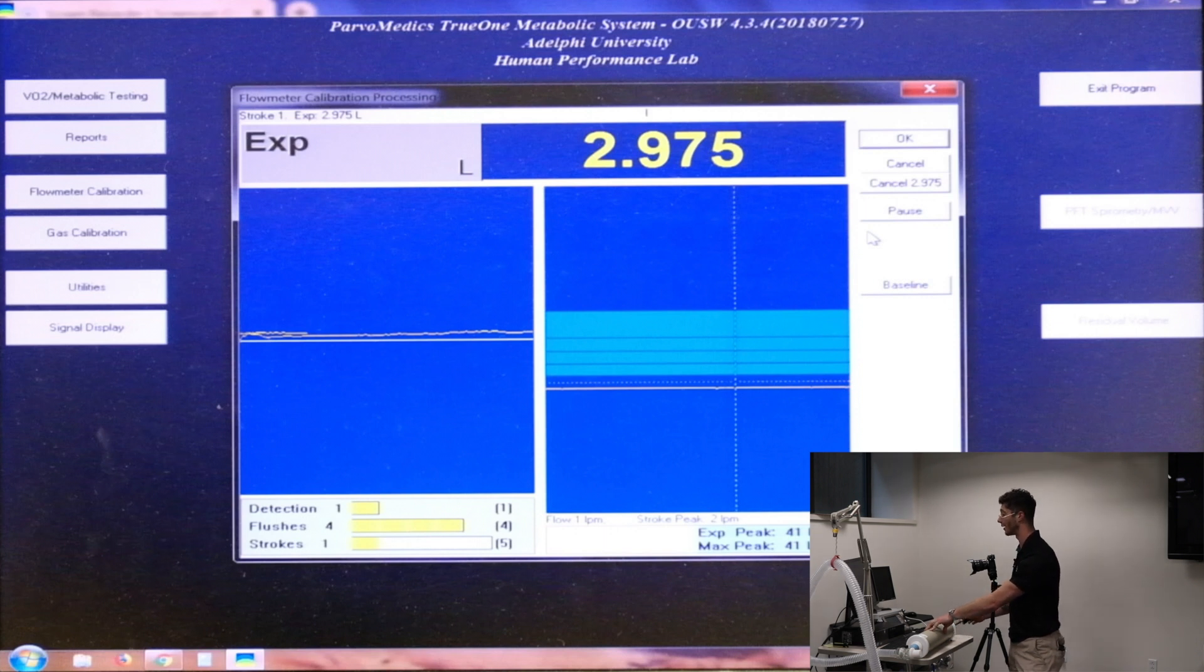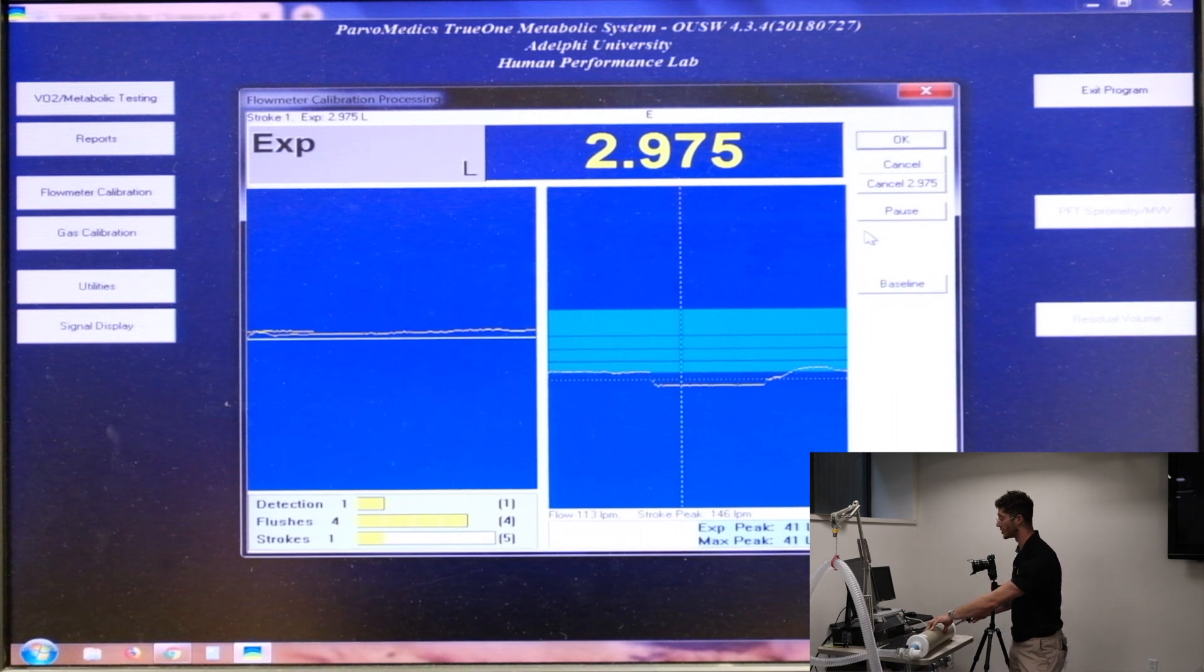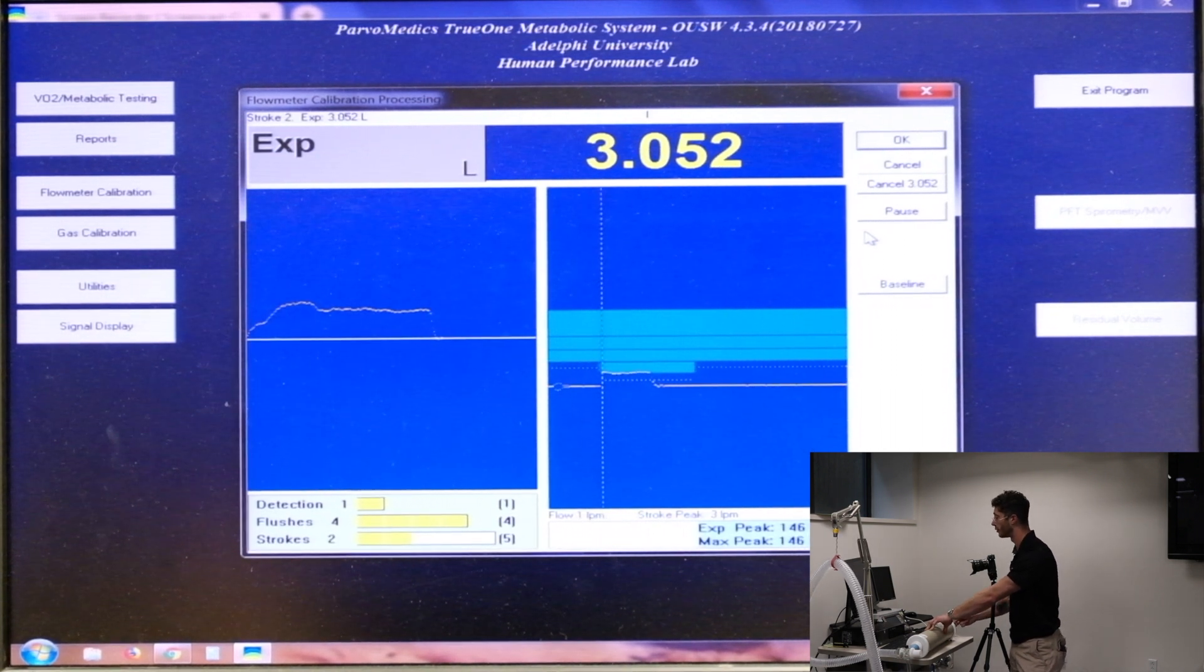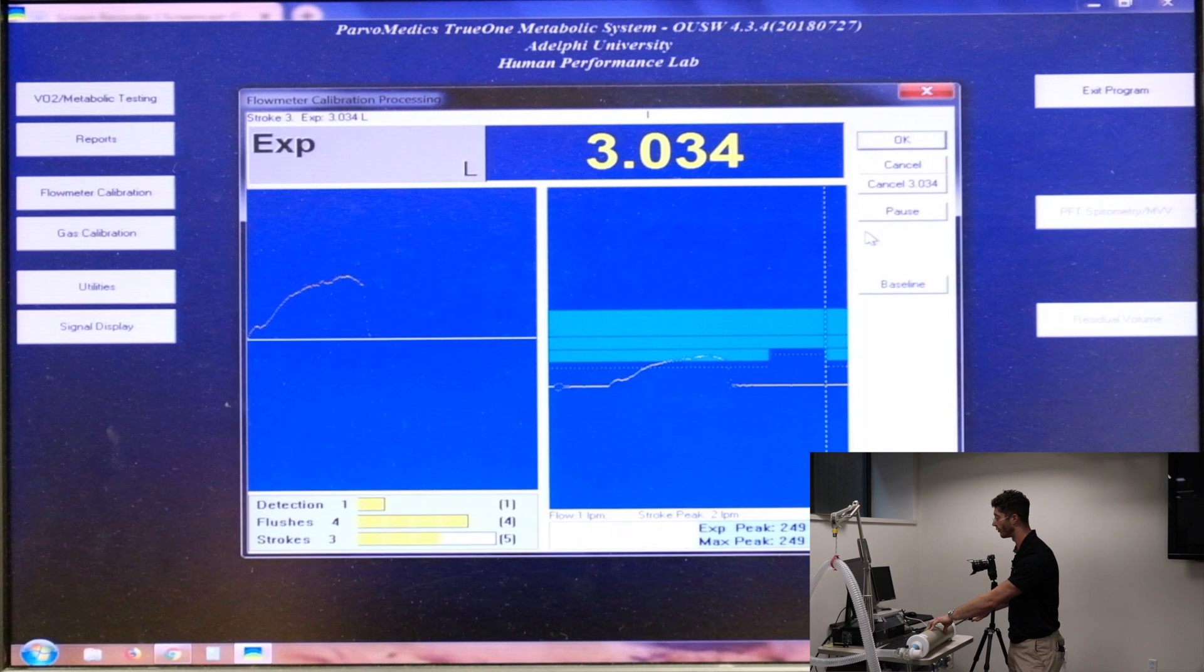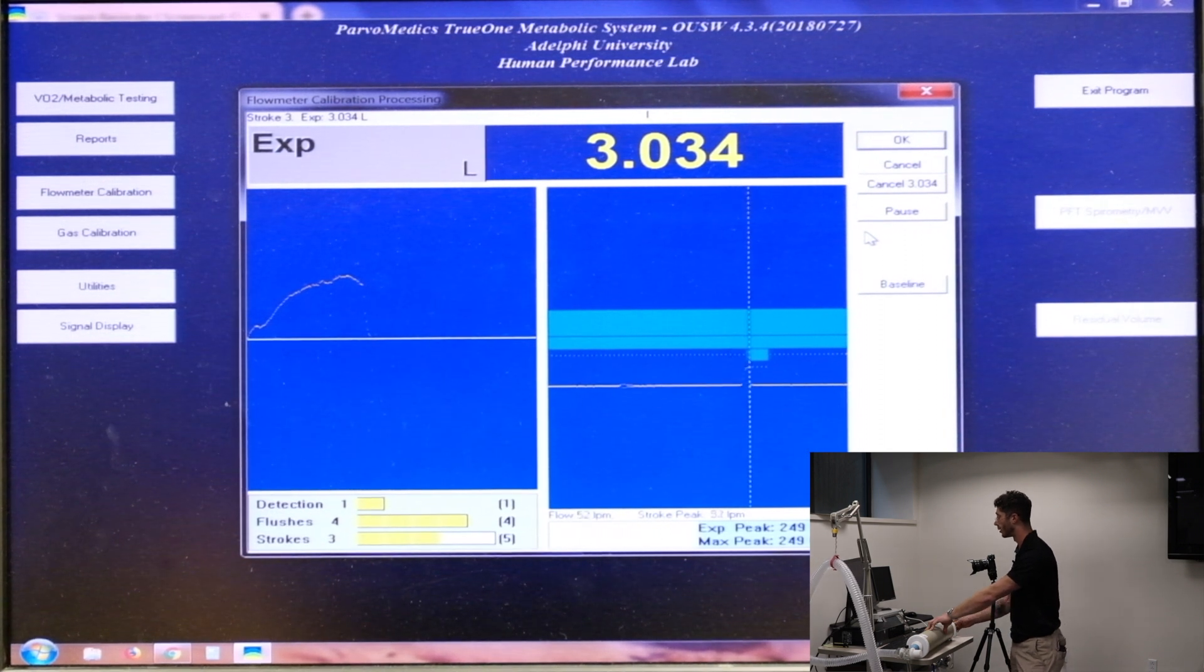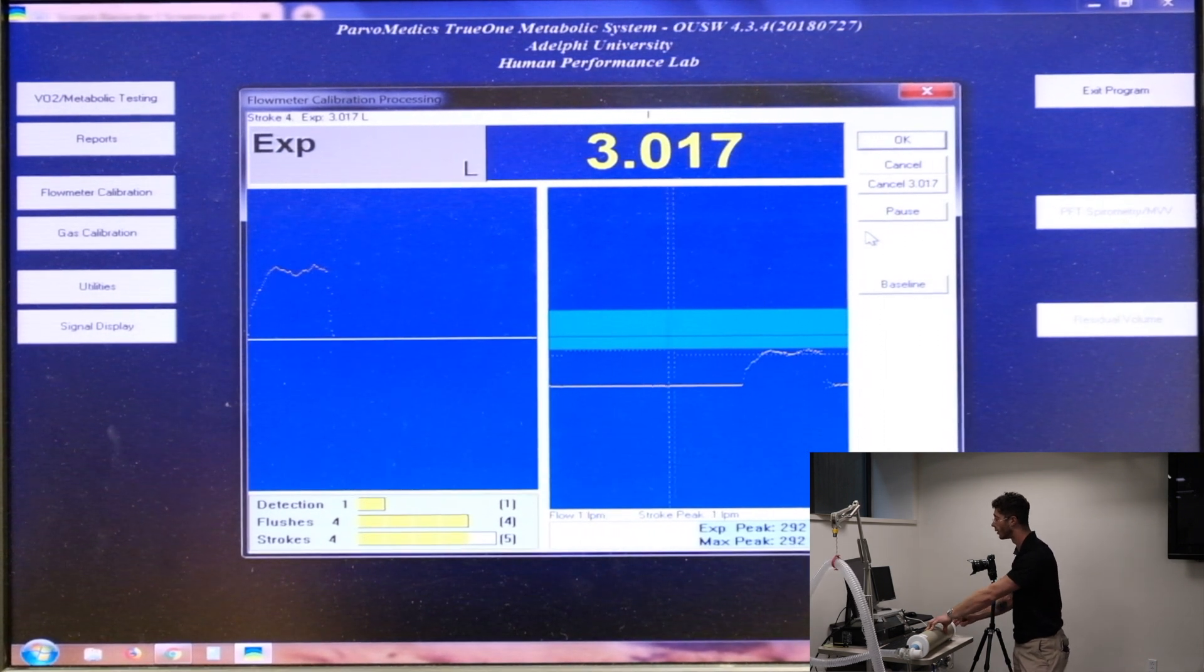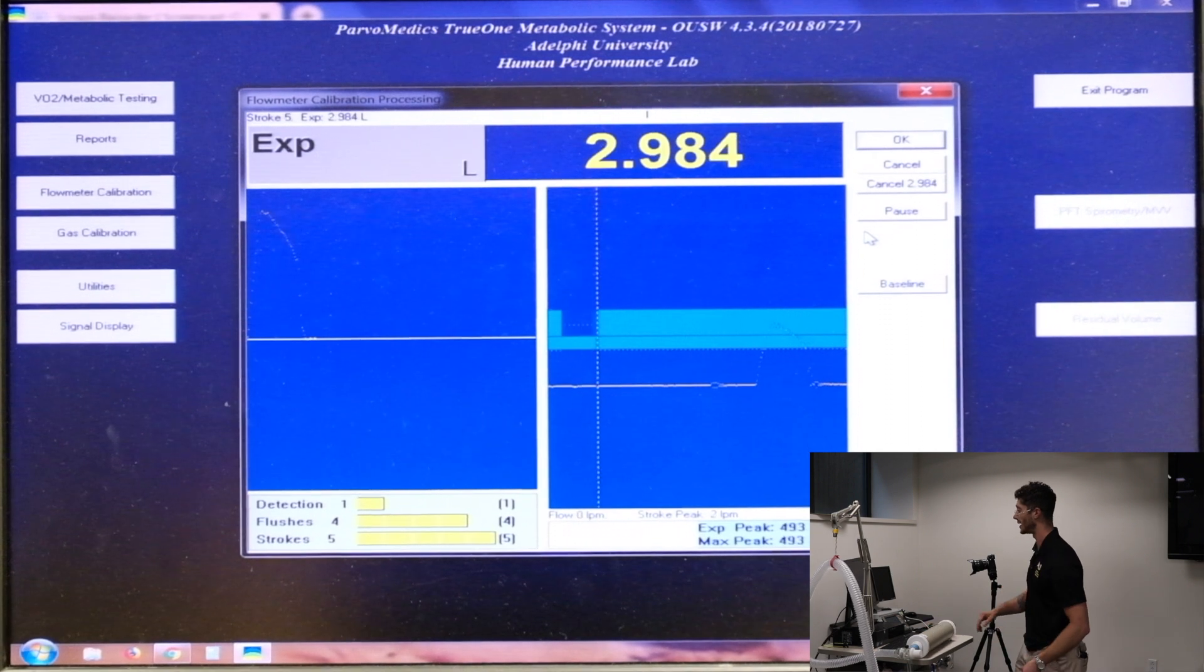So we'll go ahead and go a little bit faster, trying to clear the next blue line, 3.052. Next one, 3.034. Last one. And that is it.